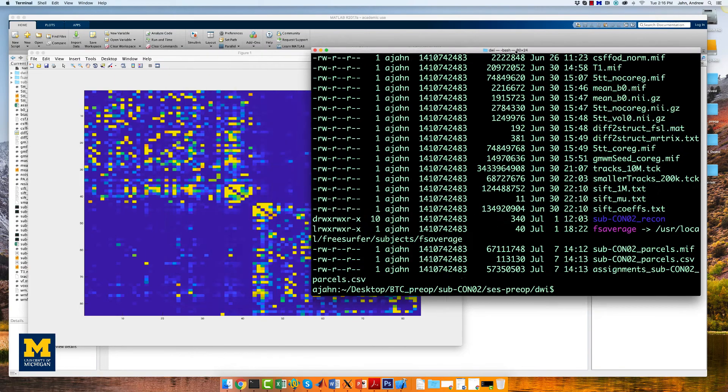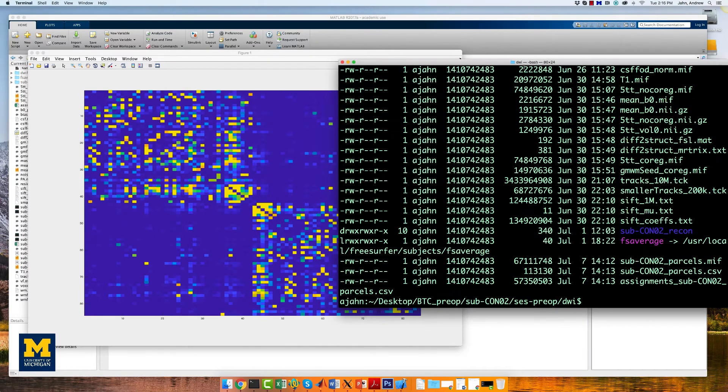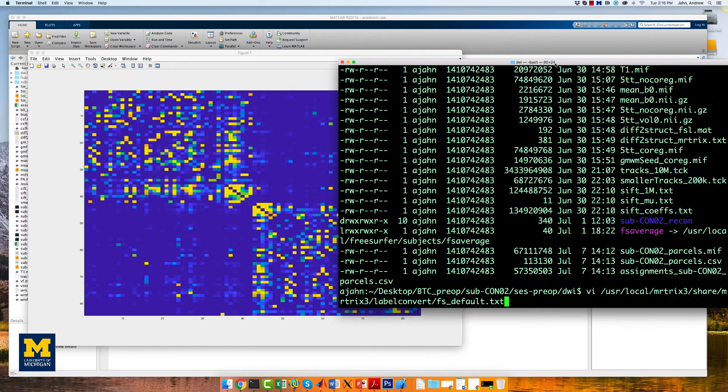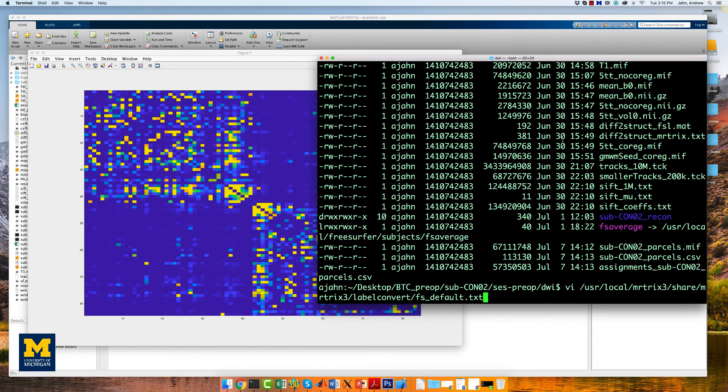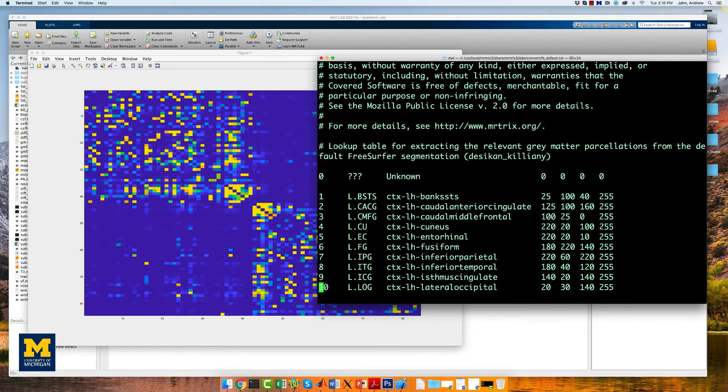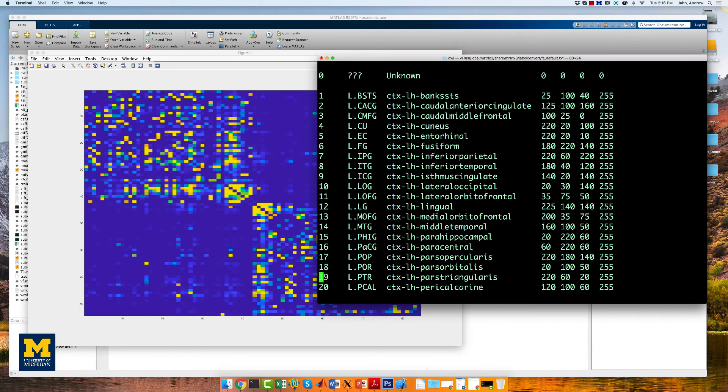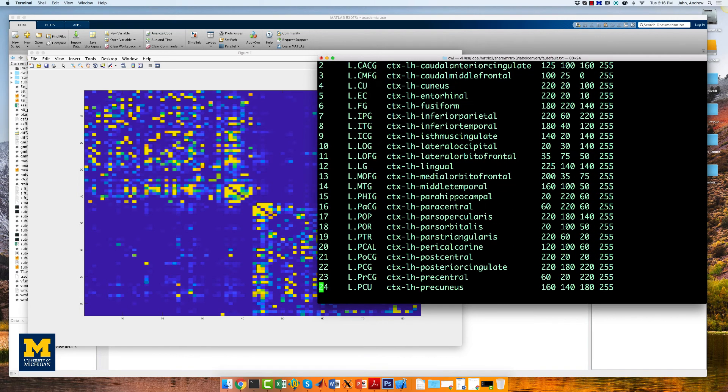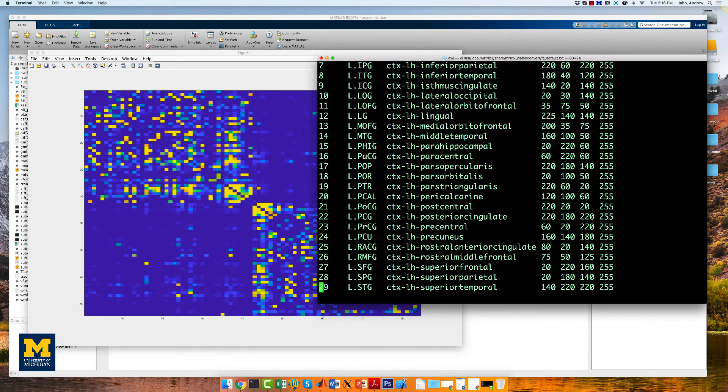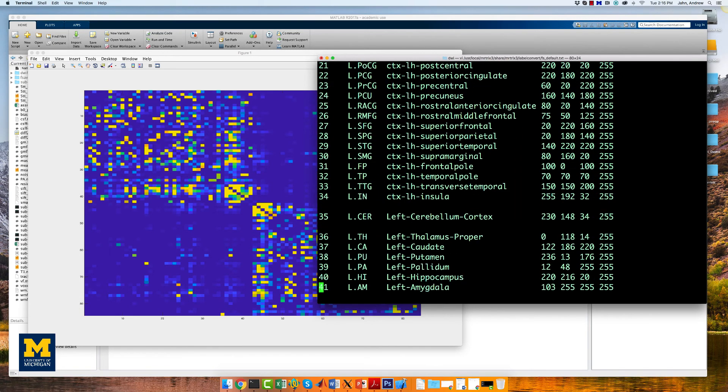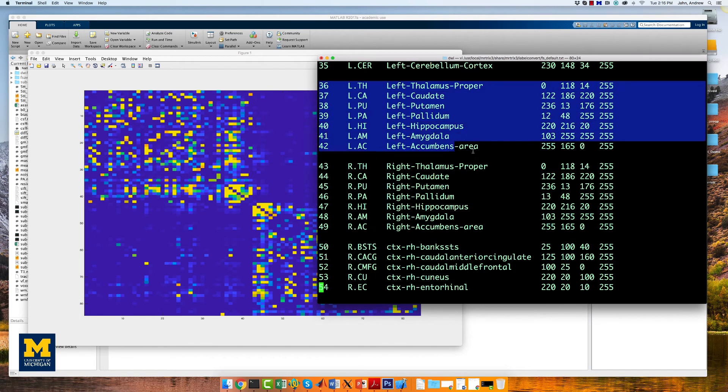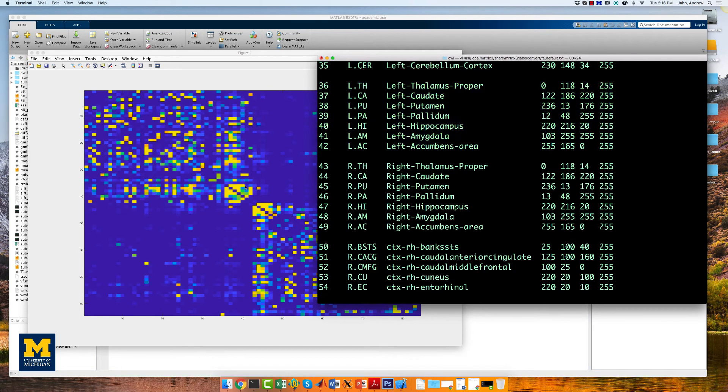If you open up a terminal and type the following to open up the lookup table, here I'm using the VI editor, you will notice that the nodes are grouped into distinct areas. The subcortical structures of the left hemisphere, for example, if we scroll down in this table, are nodes 36 through 42, which you can see represented here.